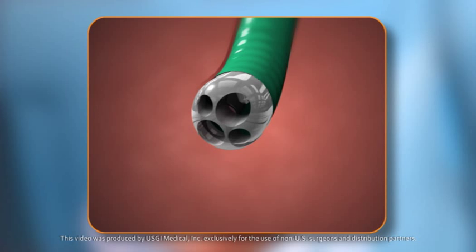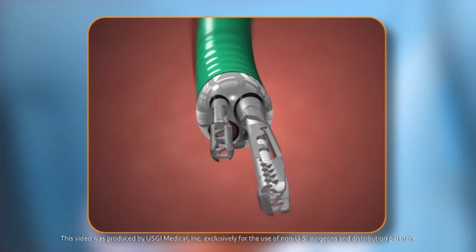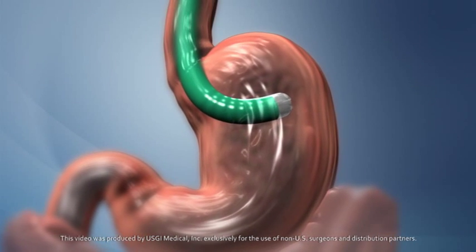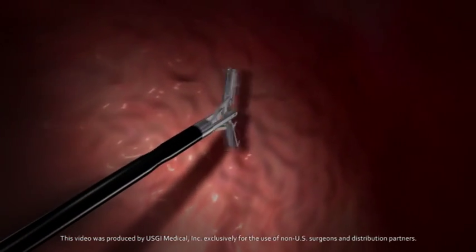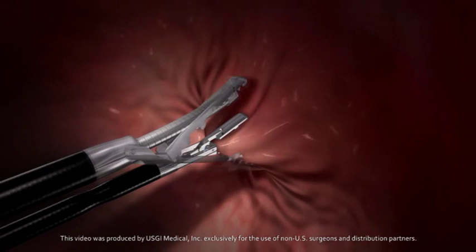Special instruments are passed through the four channels in the tube, including a scope to visualize the surgical site and graspers to grab tissue and suture folds into the stomach. These folds provide a tool that will help decrease the sensation of being hungry.